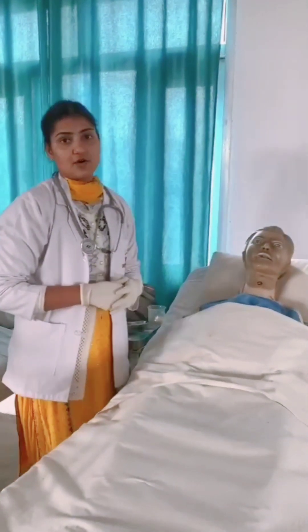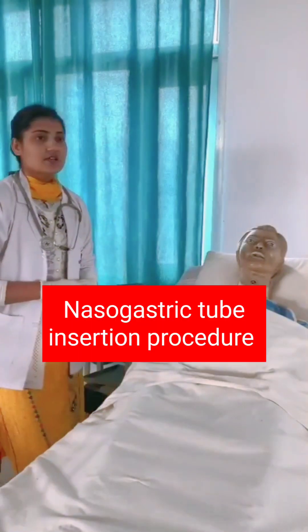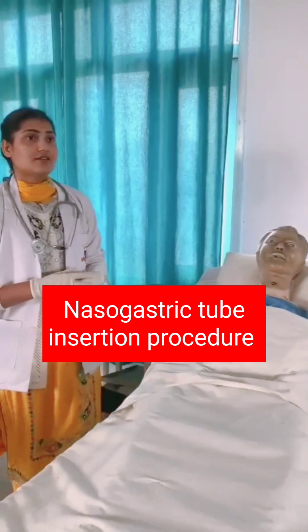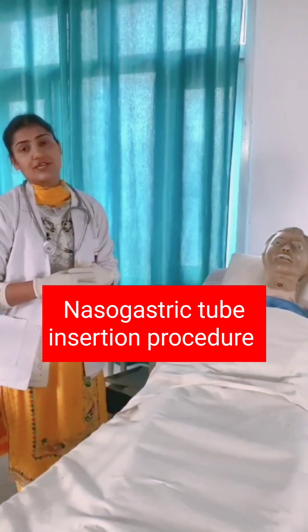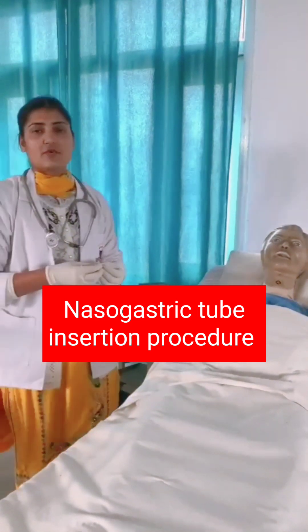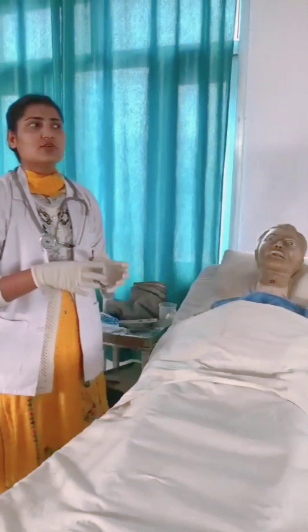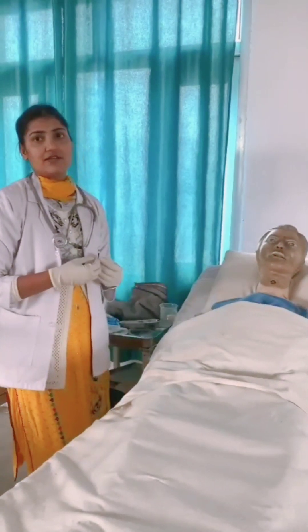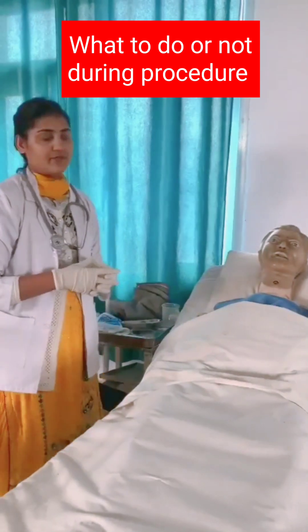Today I am going to explain how to insert the nasogastric tube inside the nostril. There are some basic indications in which we can administer a nasogastric tube. First of all, if the patient is unable to eat through the mouth, we can administer a nasogastric tube. If there is any ulceration inside the mouth or any impaired gastric motility, the tube makes it easy for the patient to get a meal at a proper time.